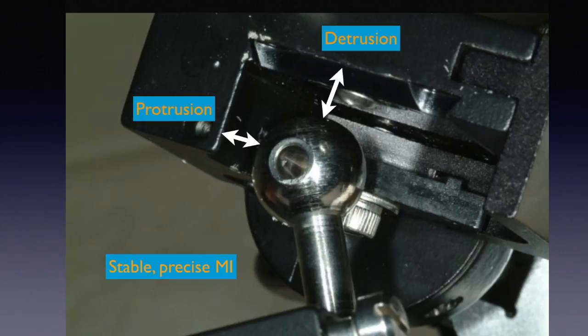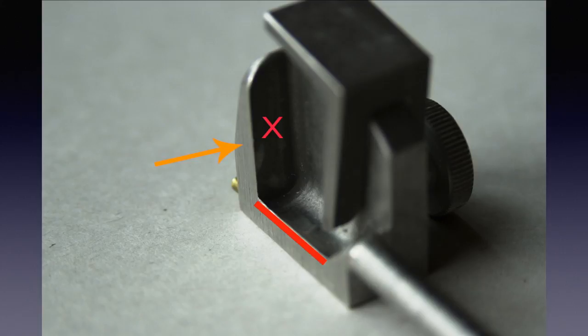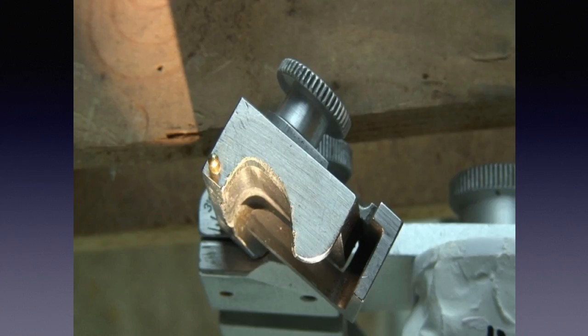In other words, you will see how much retrusion and how much surtrusion will have to be accomplished during the equilibration. If you use a Whip Mix articulator, it is essential to cut away the outer wall to visualize where the ball is when the casts are in MI. Cut back the part with the X on it. When you are through, it should look like this. The lighting in the photograph is a little misleading. We have not touched the fossa, only the outer wall.